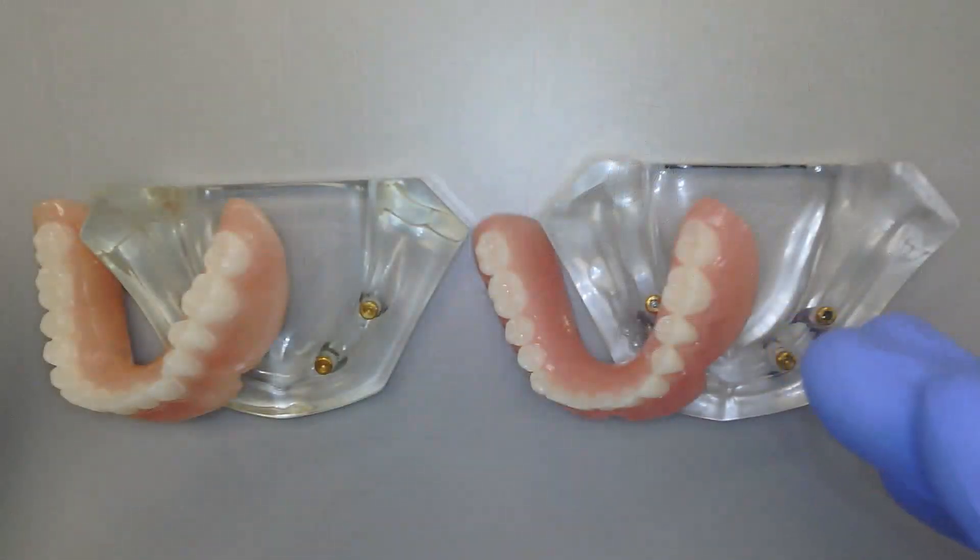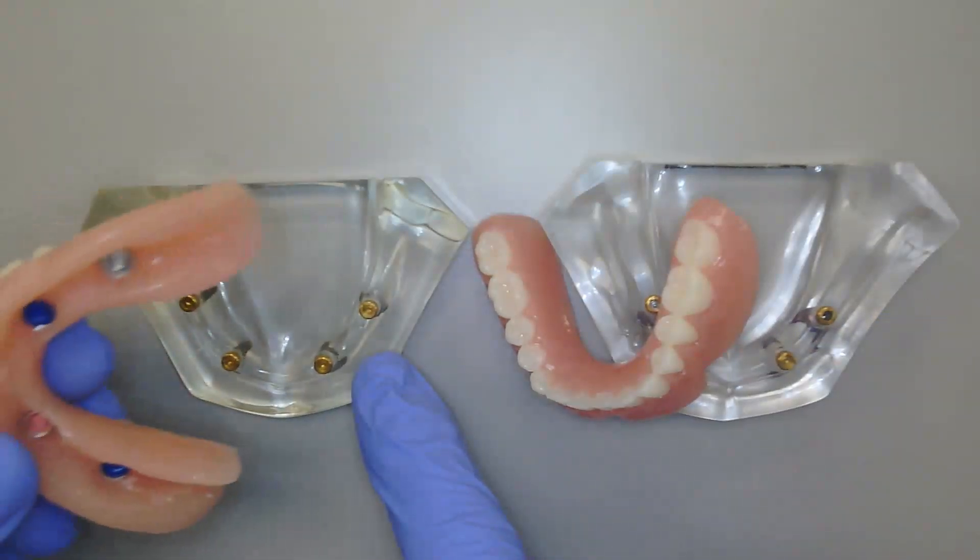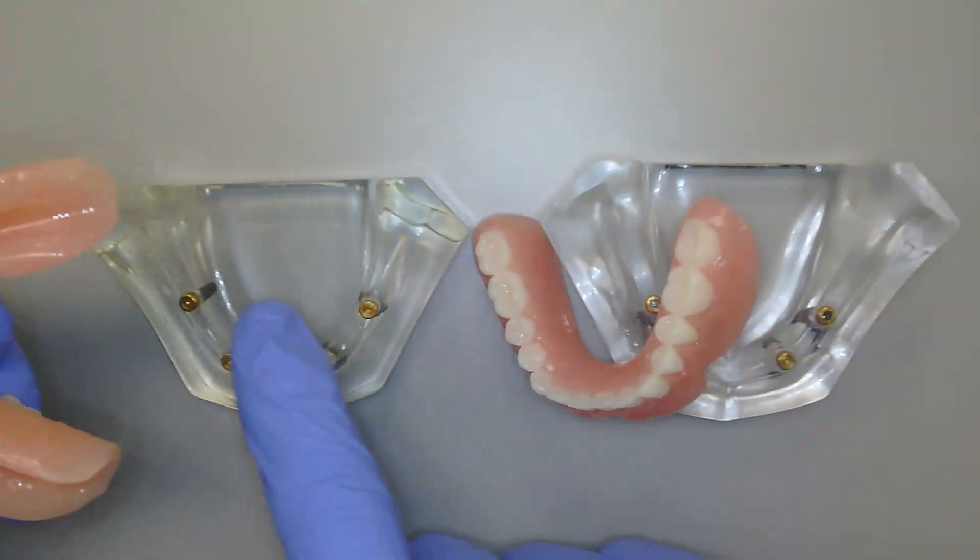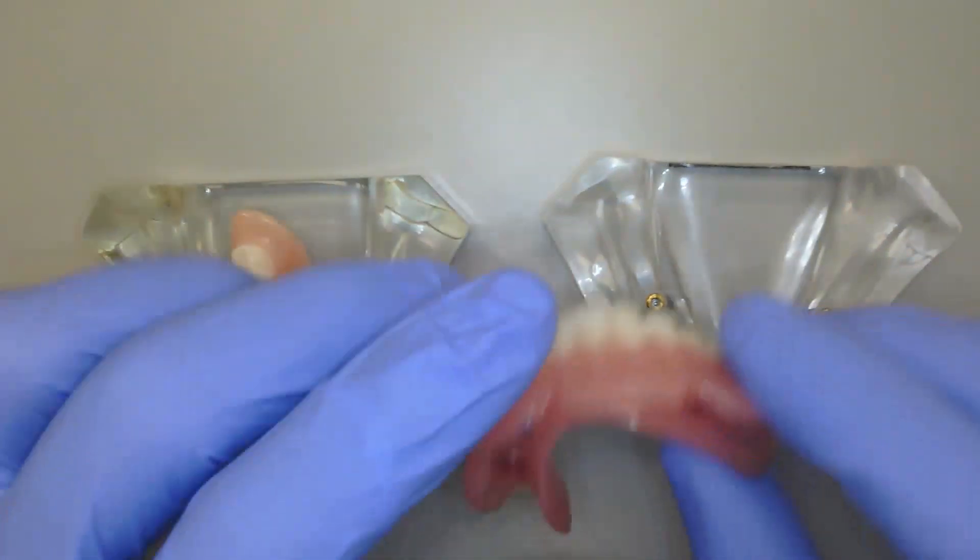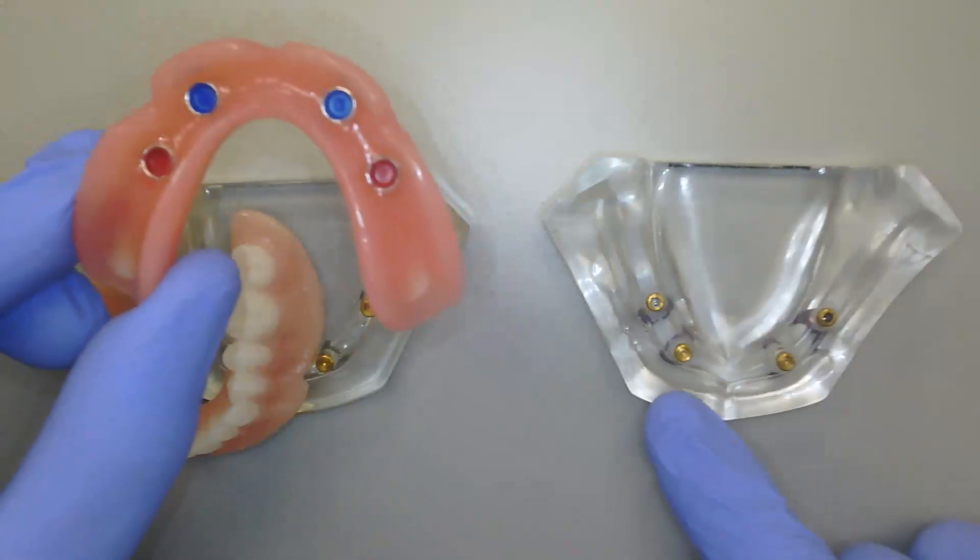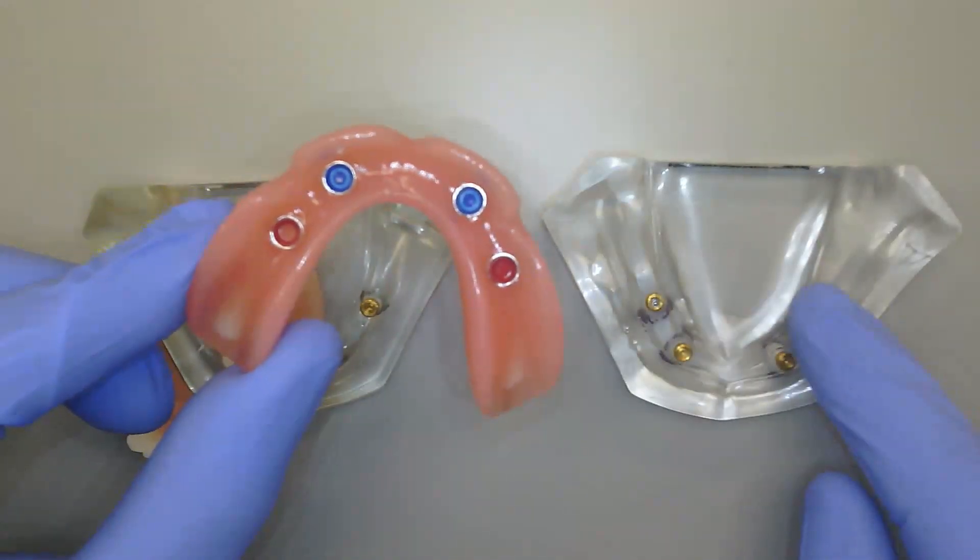In front of us, I have a couple of models. I've got our standard locator implant models with existing locator abutments, and I also have here to the right-hand side of the screen our locator angled model, which has our standard locator abutments in the front as well as the locator angled in the back.